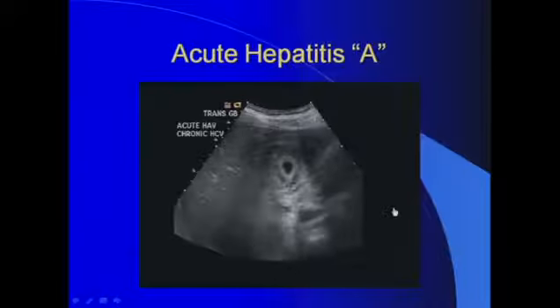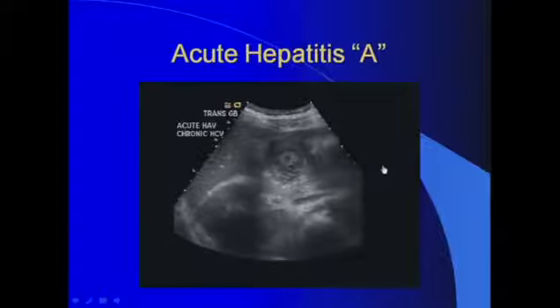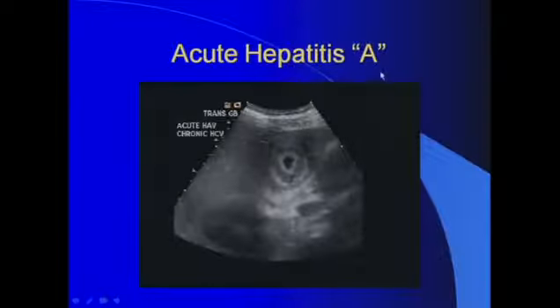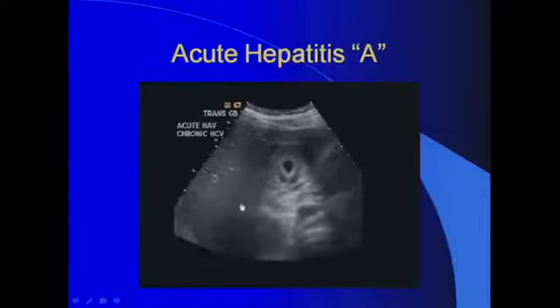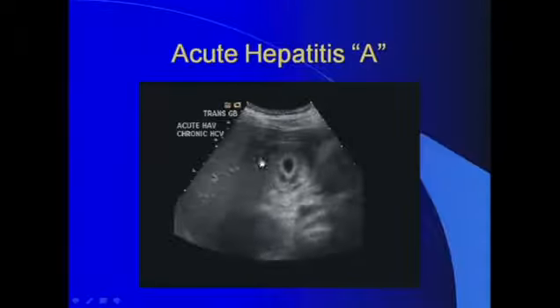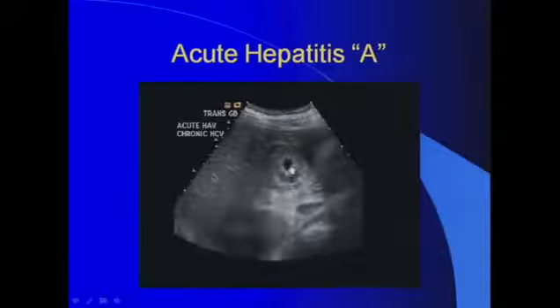Now, let's review some of the slides and the pictures in the video clips attached. So this is a patient who presents with acute hepatitis A. We have abnormal labs confirming the diagnosis, but at the time of presentation, you can see that the gallbladder has a thick, irregular wall thickening, and you can see how tiny the residual lumen of the gallbladder is in this setting.